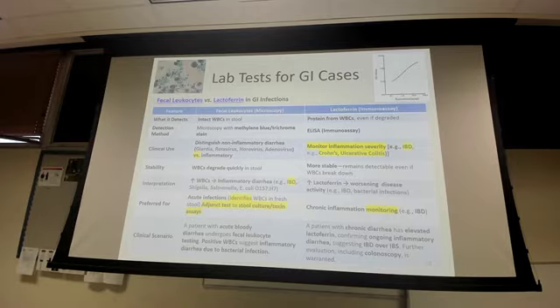We use a methylene blue or trichrome stain, and this helps us distinguish non-inflammatory diarrhea from inflammatory diarrhea. So if we see an increase of white blood cells, we think inflammatory. We see this in IBD, Shigella, Salmonella, and E. coli. And this lets us know that there's an acute infection going on. So increased white blood cells: inflammatory, acute infection.